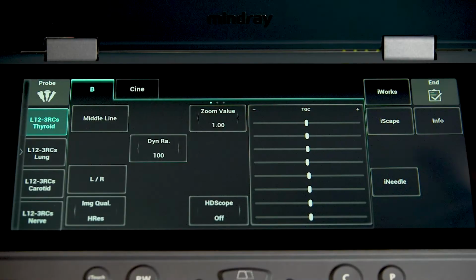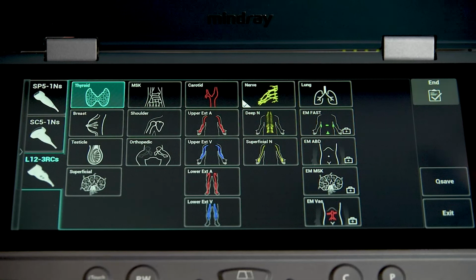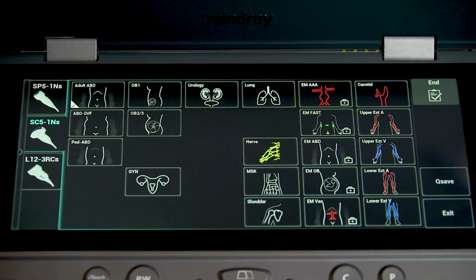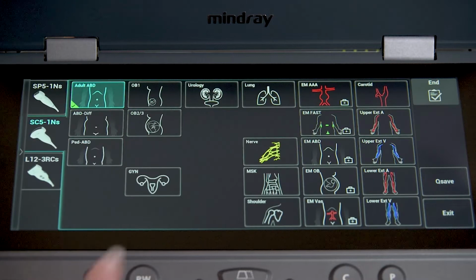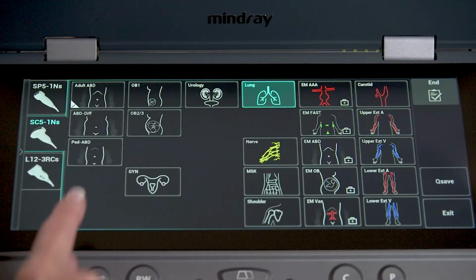Next, choose the Probe tab. This is where both probe and exam preset are selected. Tap on the picture icon of the desired preset to begin. Note that tapping on the picture of the probe itself will activate the default preset, which is demarcated by a check mark on the icon. Return to the Probe tab at any time during scanning to change presets or probes, or to reset imaging parameters if needed.